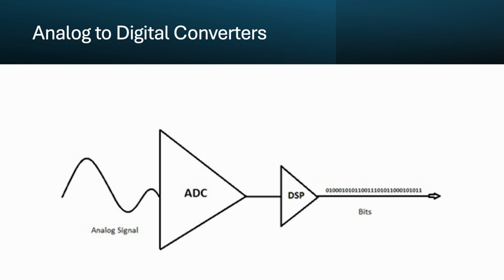Analog to digital conversion translates continuous bioelectric or analog and ancillary device signals into discrete numerical values, usable numerical values. The analog to digital converter is capturing analog signals periodically at a sampling frequency or sampling rate, and it's creating numeric data points or samples.